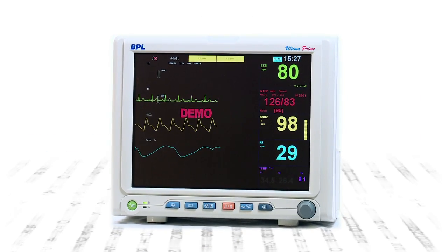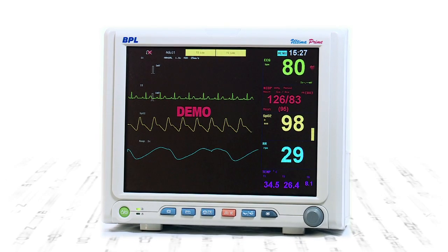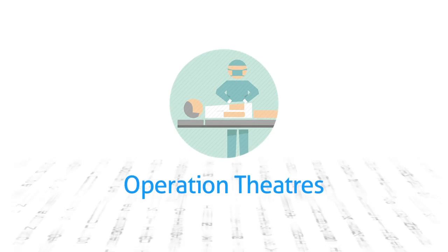Ultima Prime series of monitors provide efficient monitoring in intensive care units, wards, post-operative wards, and operation theatres.